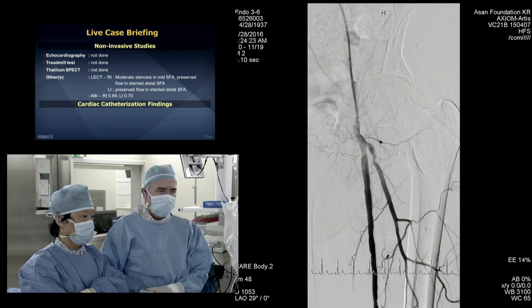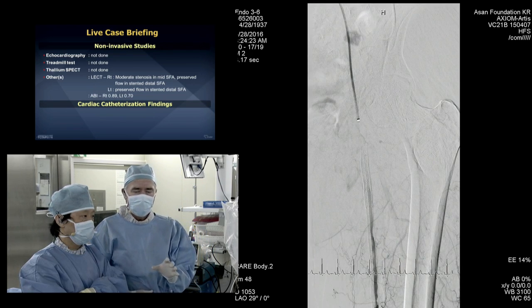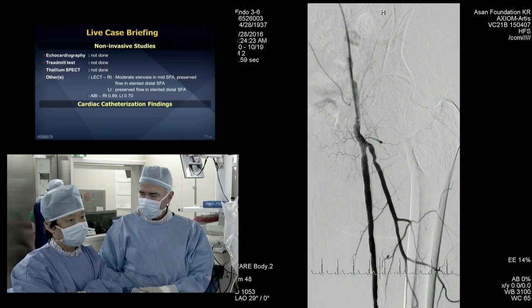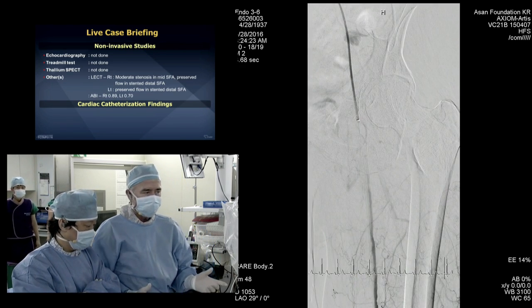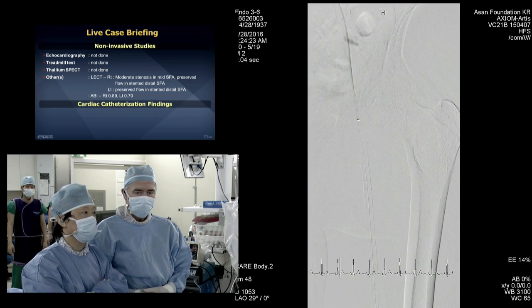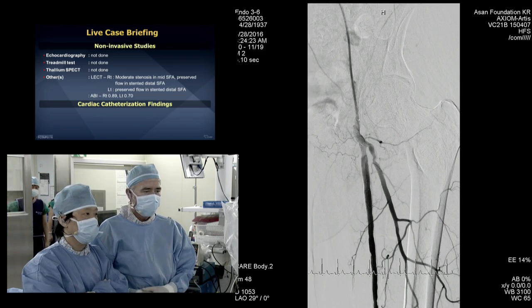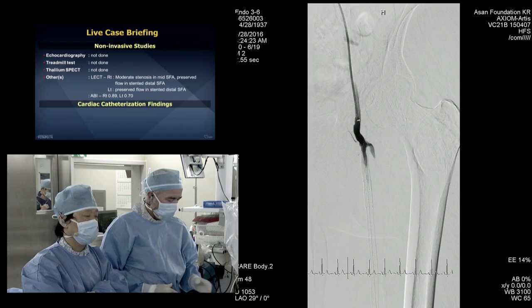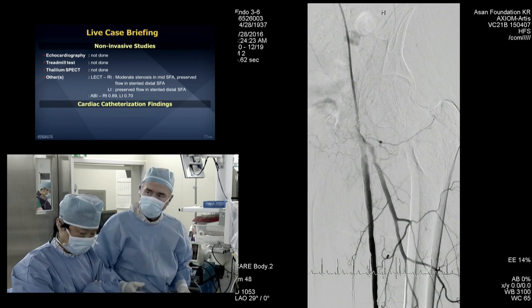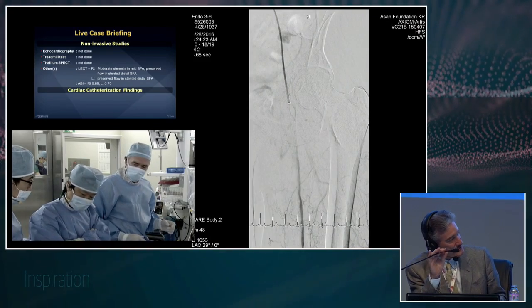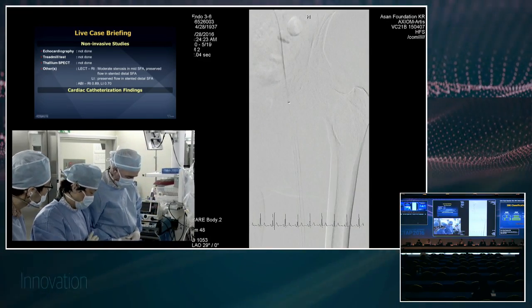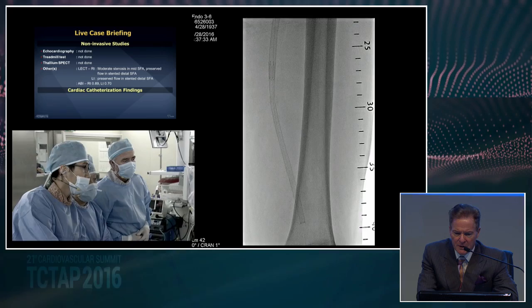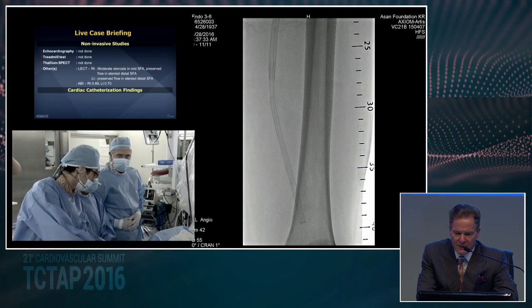The main issue is how to deal with this diffuse ISR in the distal SFA. We crossed the high-grade disease with a 0.014 Regalia wire very easily, and we're going to pre-dilate. The Excite trial has shown that compared to balloon angioplasty, laser seems to do better. I would probably favor using laser, though there are other devices to consider.